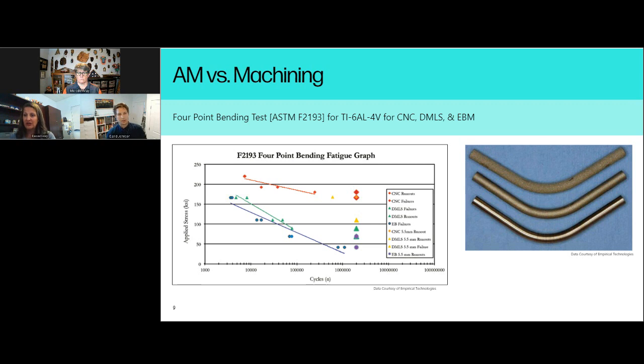And we want to make sure that we are creating pockets that match the geometry of the device that we're testing. When we do subtractive manufactured devices, we can usually just get one fit part, and that's been dialed in, either least material condition or maximum material condition. With printed parts, that could be through the entire tolerance band. So we literally fit each device to a set of blocks so that we're maximizing the fit and not, again, creating extra stress risers in the testing. So that's how we had to change our test block design to meet that need.